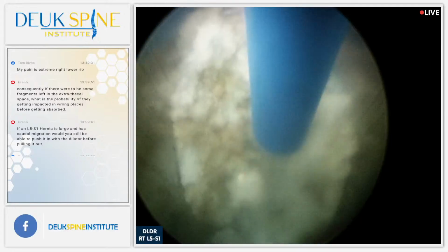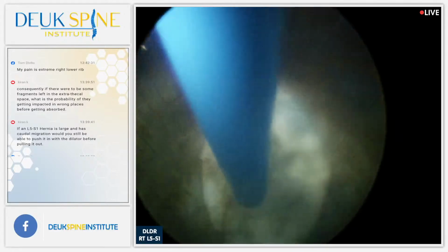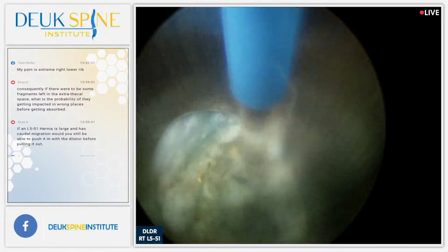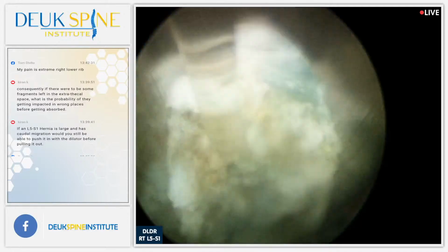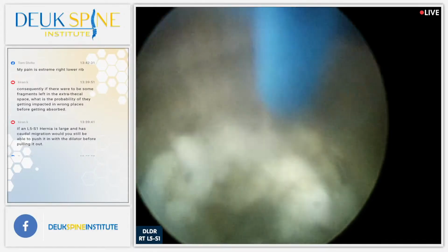How much time do we have here? With the disc, 5 minutes max. 5 minutes on the disc, then we're going to go to facets. So Henry, we've got just a few more minutes before we turn this live stream off, and we come back with the facet joint. Copy that.